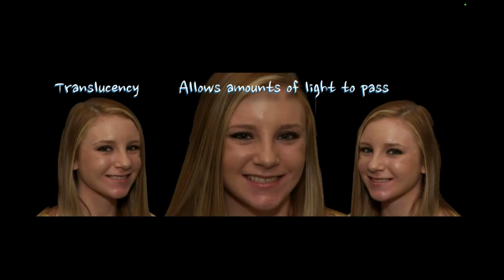If I want pure translucency, that changes the game also. I don't really need to worry so much about opacity, and I'm really looking more at how much translucency I want from my enamel materials or my filter materials, as I call them most of the time. So for me, if I want light to pass, I want to think about how much light. Like I said, 6% is about all you're going to get. But I could also use enamels that are 30% opacity, right? Or whiter or brighter enamel. So I'm thinking of how much light I actually want to pass through the process.